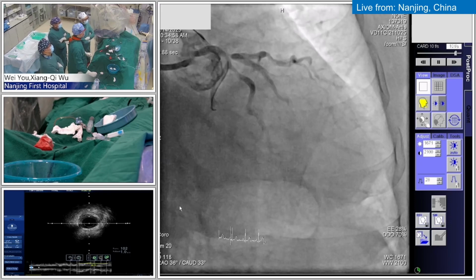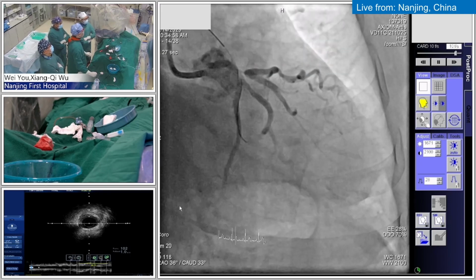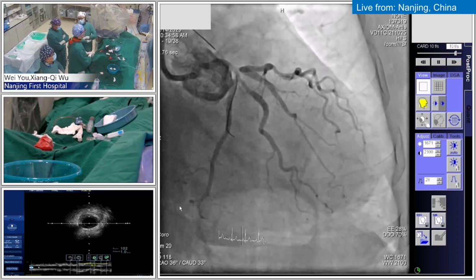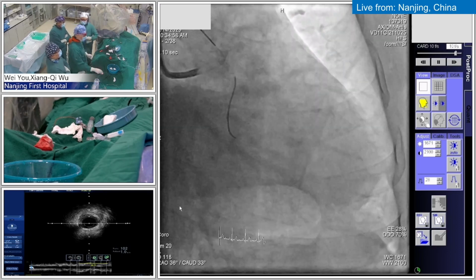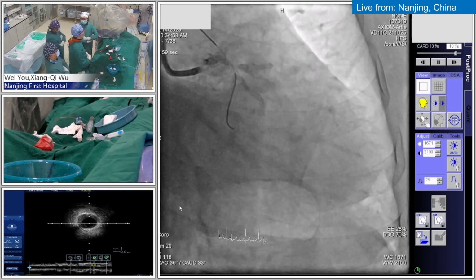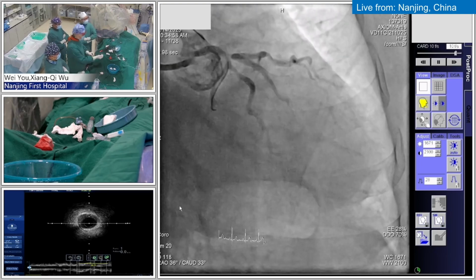You know, these are very complex distal bifurcation lesions. I think for this case, it's just a simple bifurcation according to Professor Chen's definition. So provisional stenting is my first choice, but I need to know very clearly. And of course, guided by IVUS, no? Yes, right, because it has a 2A recommendation from the guidelines.